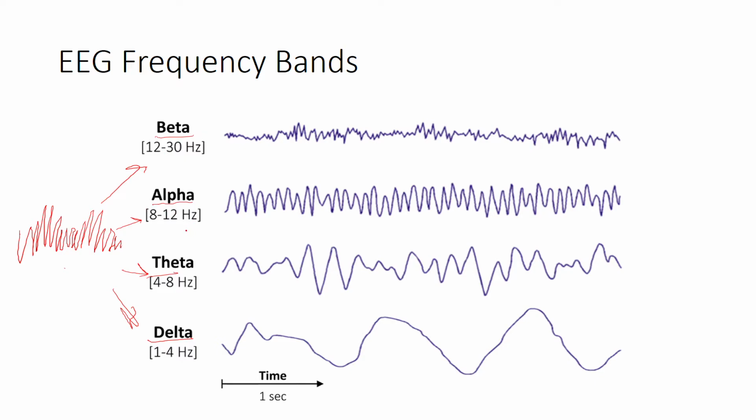So in this case, this implies the decomposition of the signal into frequency components. The frequency components are the features that you're going to extract from the EEG signals, and then you're going to classify them. So the power of each frequency band will tell you something about the mental state. We're going to cover this later.